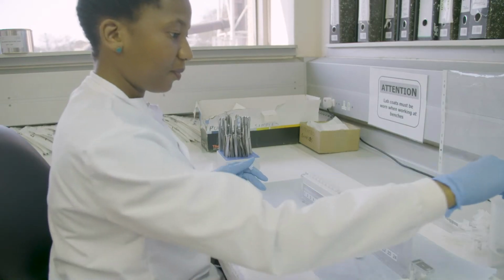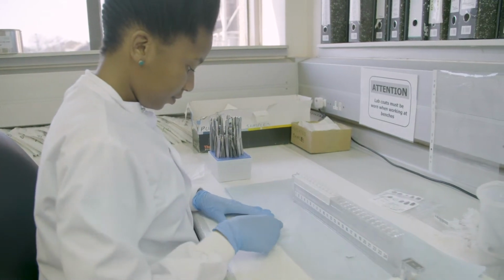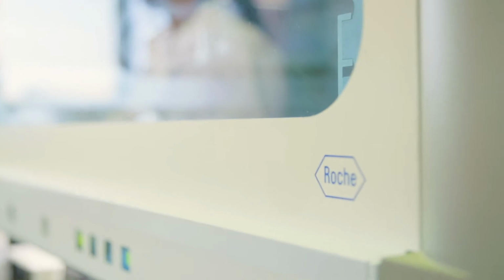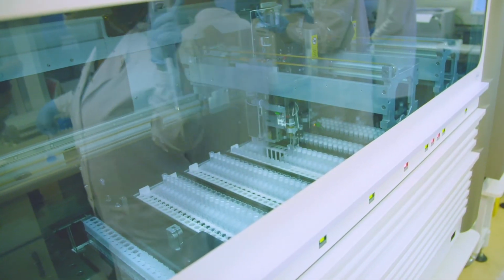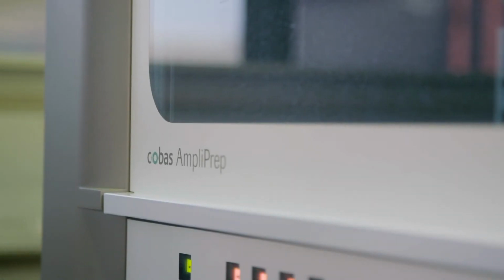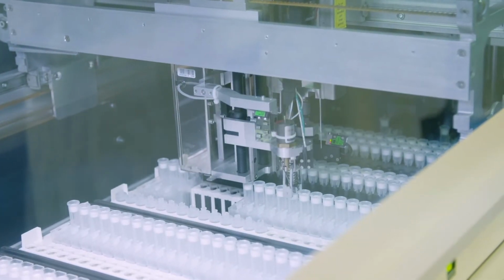In 2014, the global demand for HIV viral load testing was estimated to be nearly 7 million. By 2020, this number is expected to more than triple to almost 25 million in low and middle-income countries. There are several equipment platforms and reagent kits commercially available for HIV viral load testing. Some of these have been adapted for use with different specimen types.